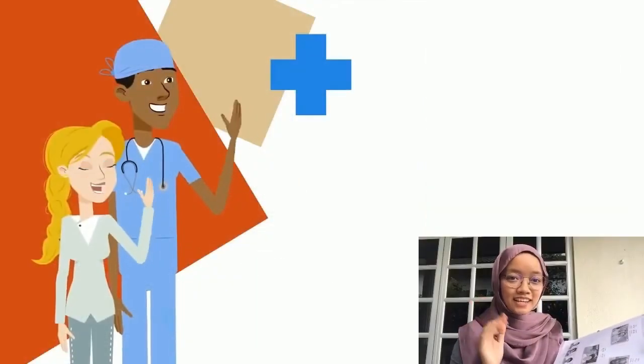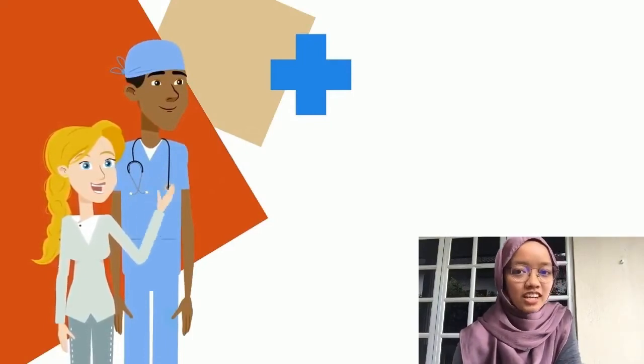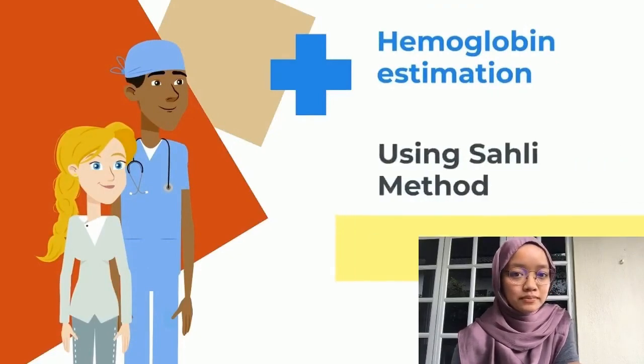Thank you. Assalamualaikum and hi. Today I am Alia Najha and I will explain to you the result of hemoglobin estimation by using Sahli's method. So let's discover the result together.